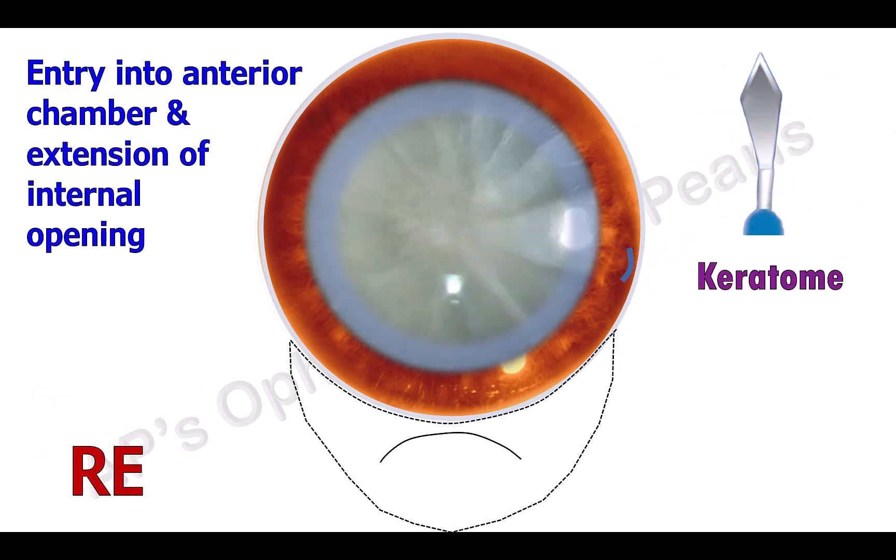The anterior chamber is entered with a keratome. This is the third plane of the triplanar incision, and the incision is extended on either side to complete the internal opening of the tunnel.